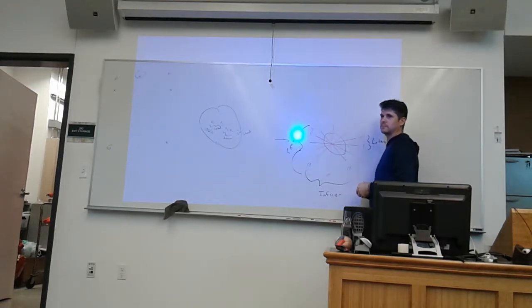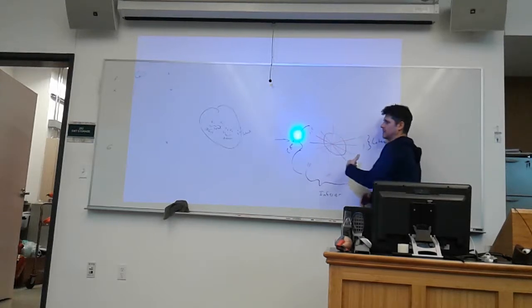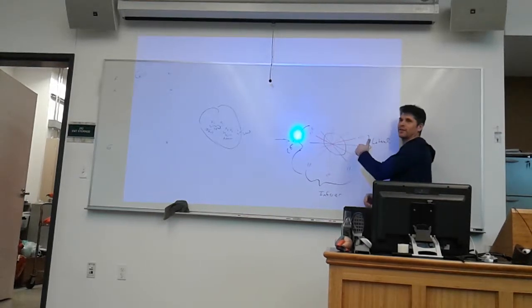So it's impossible to just do a V lead. It wouldn't work. You'd have to have the rest of the leads too. That's why, when the 12 leads are put on, it's always a separate set of cables put on separately. You have to have these first to get into the correct algorithm. If you just did these, not only would you only have one wire, because you wouldn't have the thing that's creating the negative, which would be your second wire, you also wouldn't have your ground. So you have to have the limb leads on in order to see the rest of the 12 leads.